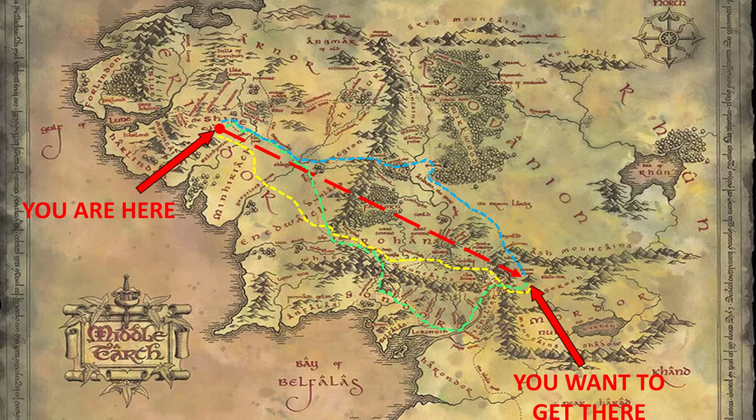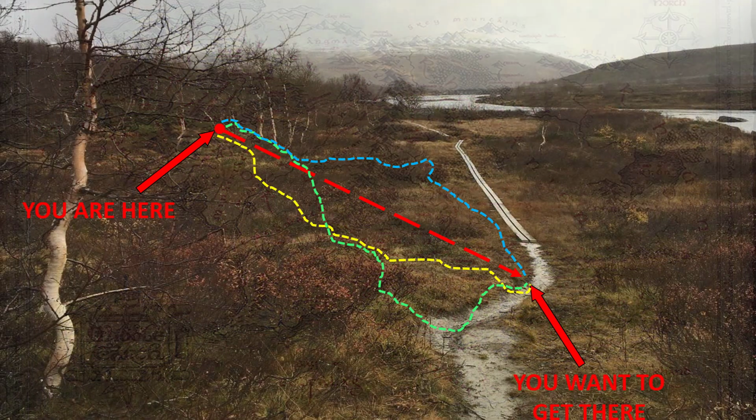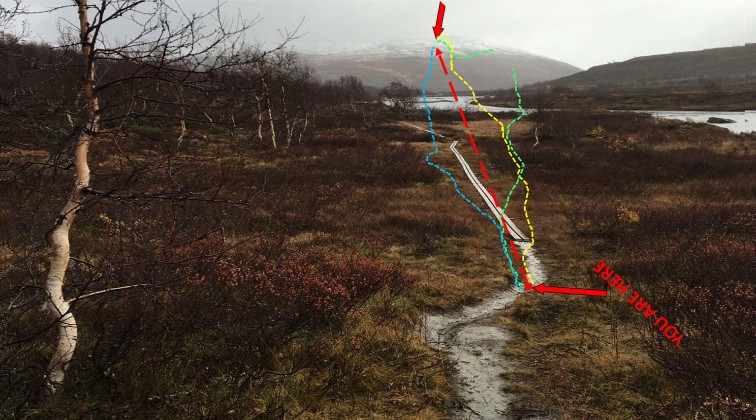Visual programming is great when you want to know where you are and where to go, but in order to get there, you need to align the map with the real world, and that is the actual stimulation response. Remember that it is not visual programming or stimulation response guided programming, but a combination. We use a map to find the general direction, and we will then decide on the exact field of stimulation based on the stimulation response encountered.